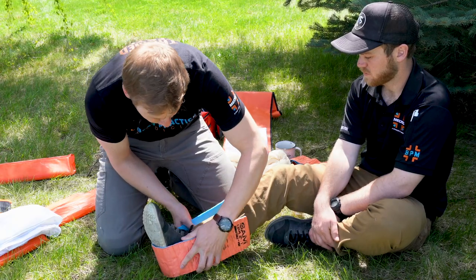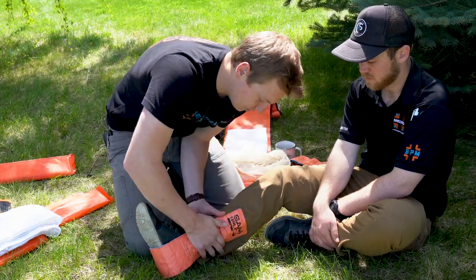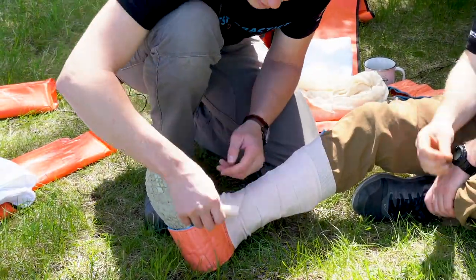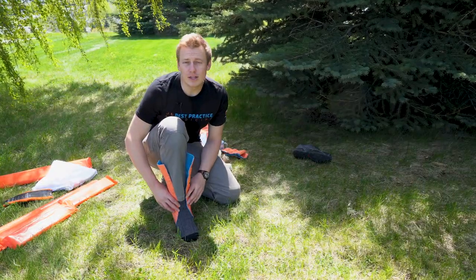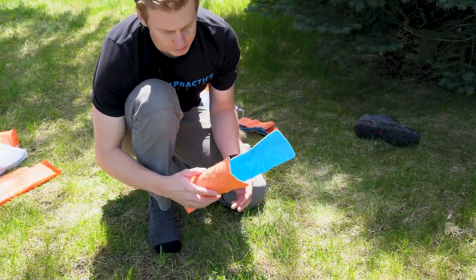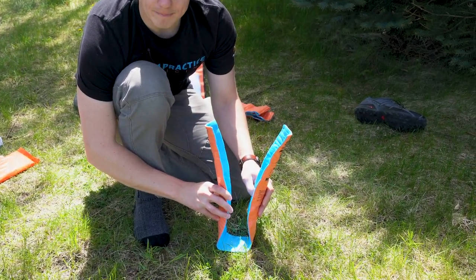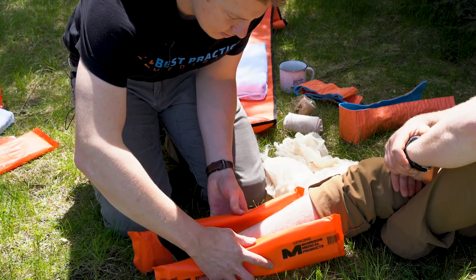Next, you'll form the splinting material to match the patient's anatomy. Then we'll secure the splinting material using Ace bandage, Coban, or other wrapping material. Remember that the strength of a Sam splint comes from the cylindrically shaped channels. So to build a strong splint, carefully form the splinting material to the patient's body to ensure structural integrity. Select the proper splinting material and position it next to the patient's body.